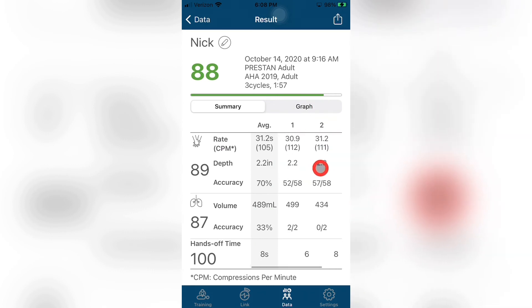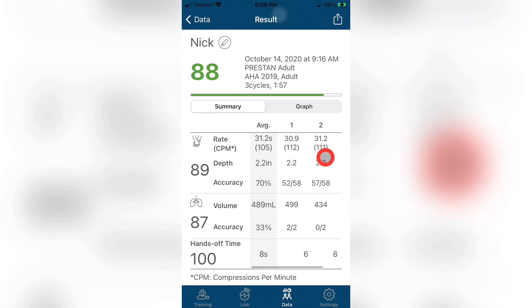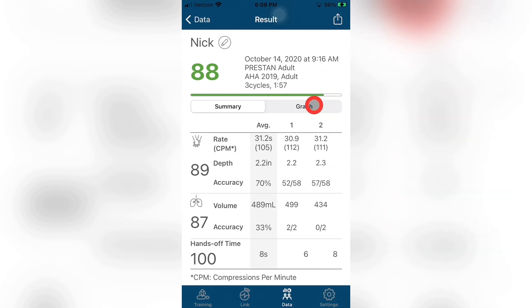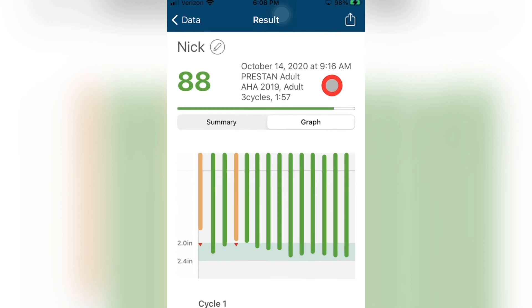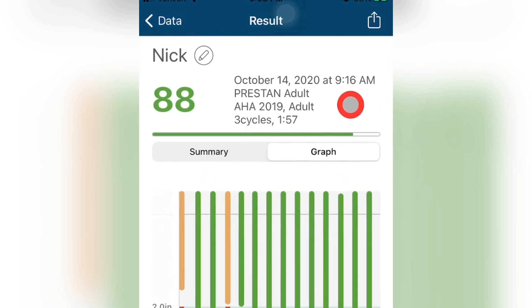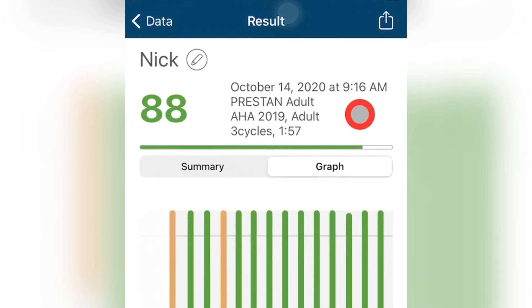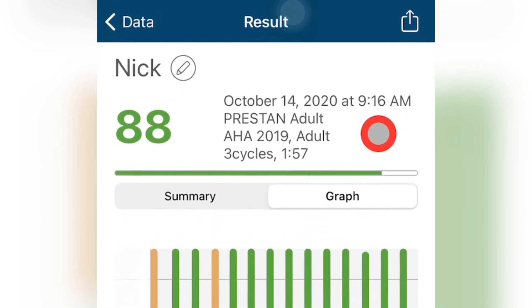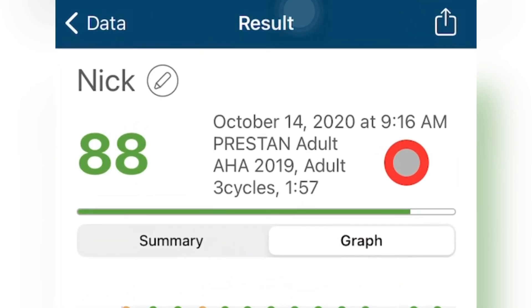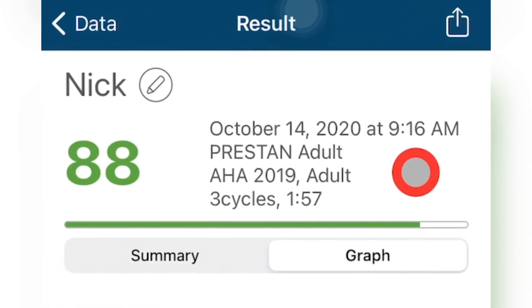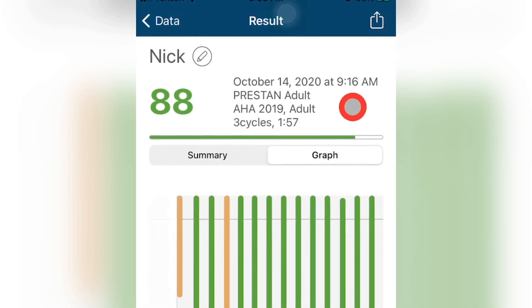Moving to the Graph button. Once the graph button is pressed, the screen will change to show the detailed data that was recorded for the training session. At the top of the graph screen is the summary of the training session. This includes overall session score, date and time, training device used, number of cycles, and lastly, duration of the recorded training session.